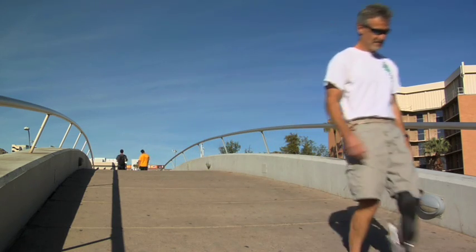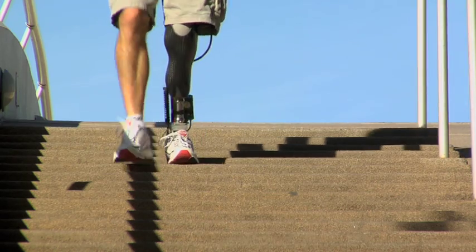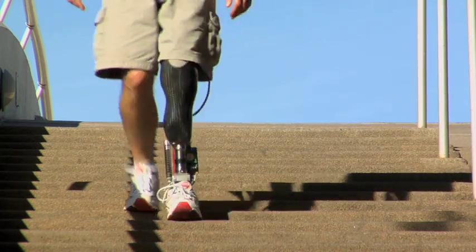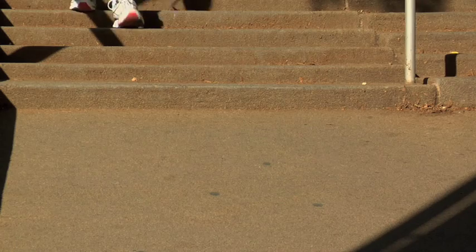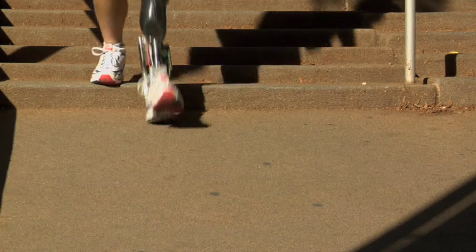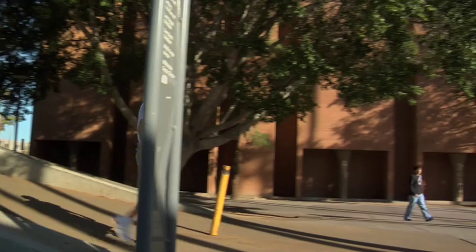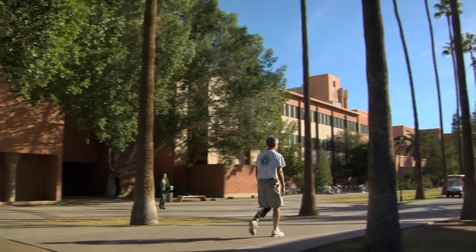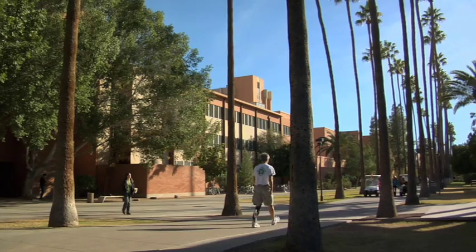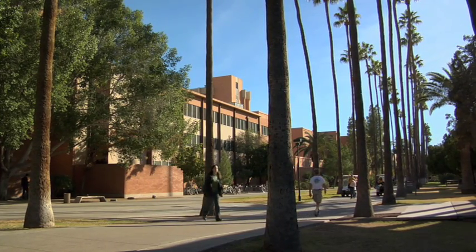We've been told by users of the powered ankle that it allows them to walk naturally. They don't have back pain anymore because the ankle articulates. They say that it just feels like natural walking — it knows how to walk up and down slopes and stairs, because those are the most common things you do walking throughout the day. Those are the most important things to make the amputee feel comfortable.